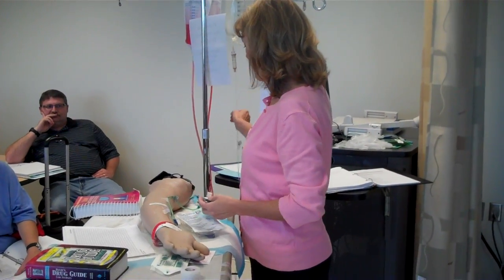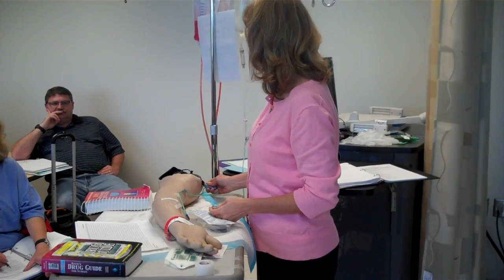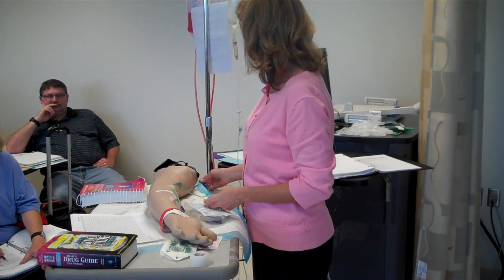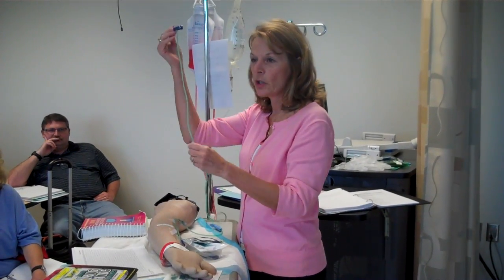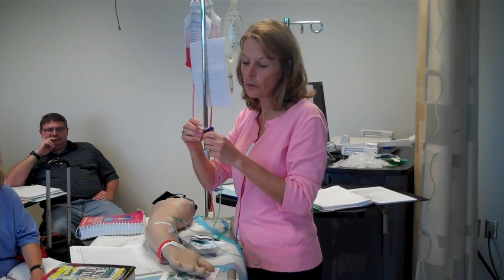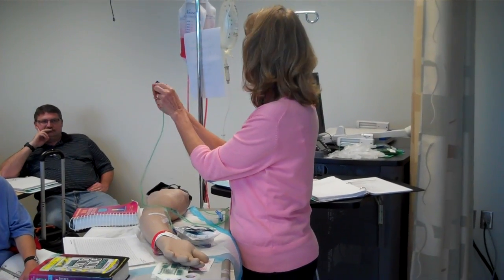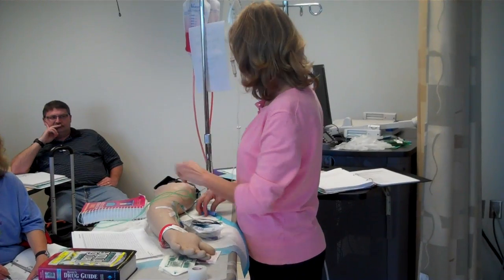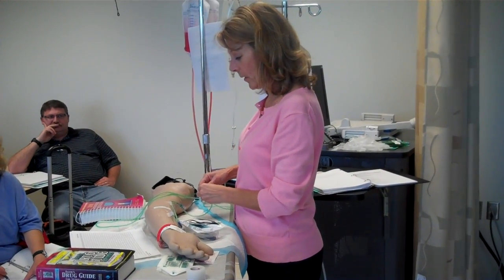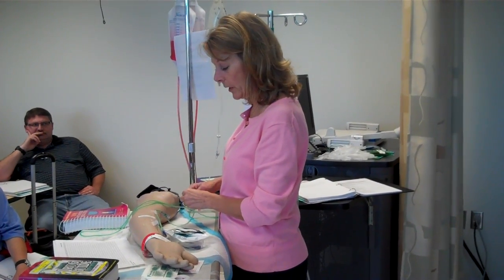So my primary is running right now, so I'm just going to start running here. And if it doesn't run, go back and check all your clamps. Okay, one's probably closed, and this one closed up when I pulled it out of the IV pump. It closes it up on you. Okay, so I have this running, and it looks good.